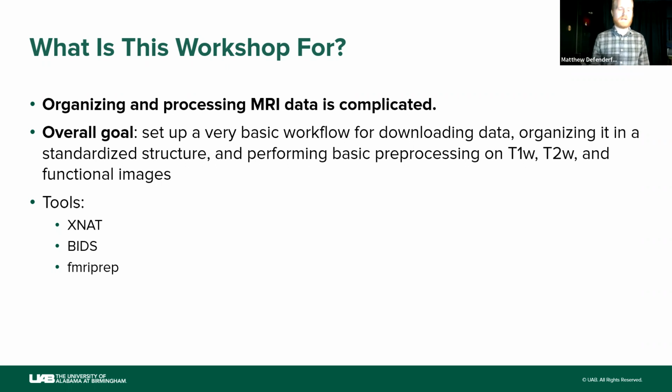There is documentation on the site, and I'm going to give you a link to our documentation at the very end. There is documentation on how to get an Xnat account set up and how to set up a project for you to be able to push your data to it. So that's the way that we have for storing data online and downloading it from the online server.